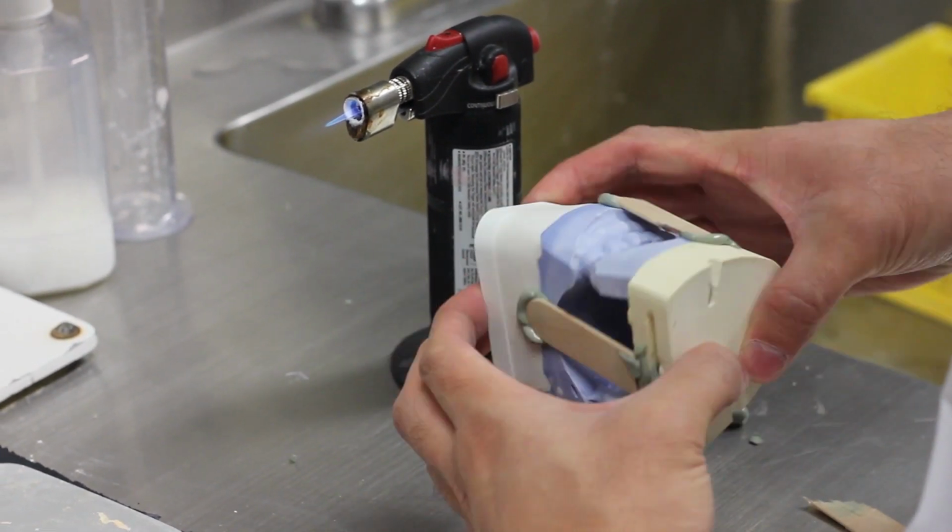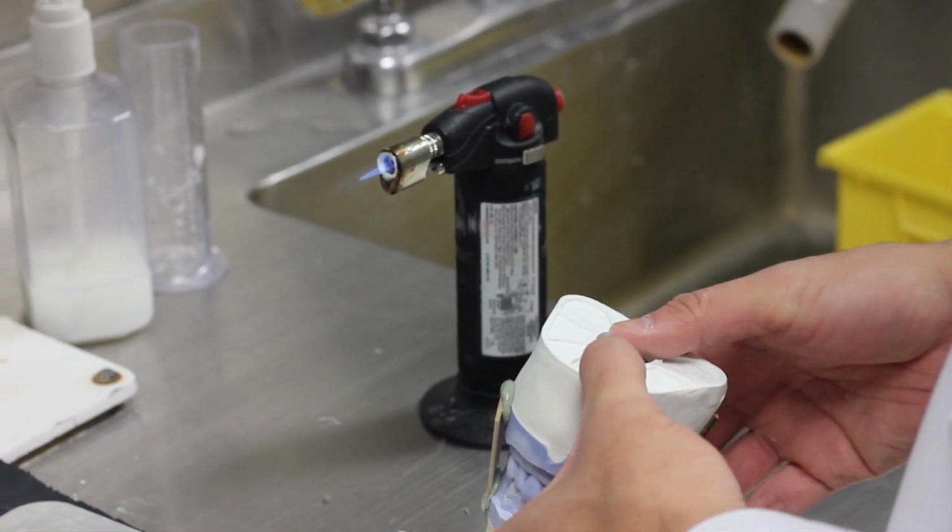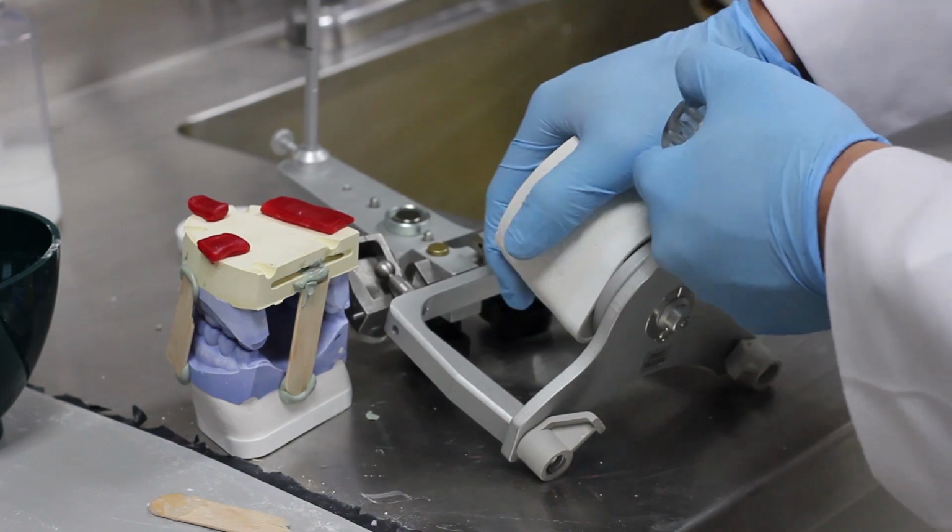So since we have a really stable occlusion, we're able to hand articulate the two casts together, which just means holding it in place with your two hands while you're mounting.